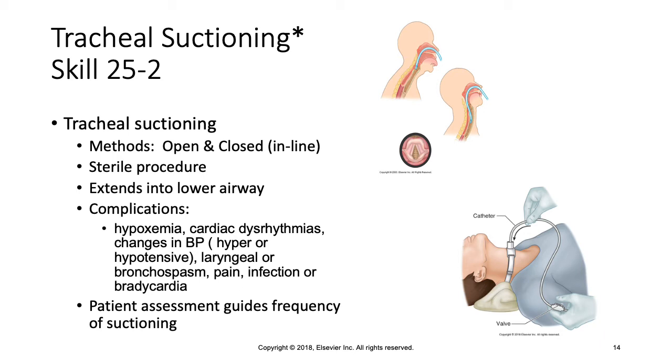We also limit our suction passes to no more than 3, and make sure that the patient gets adequate rest periods in between. So 1 minute in between suction passes, and that you suction for a short period of time, no more than 10 to 15 seconds at a time.